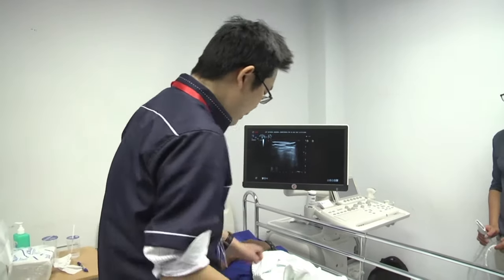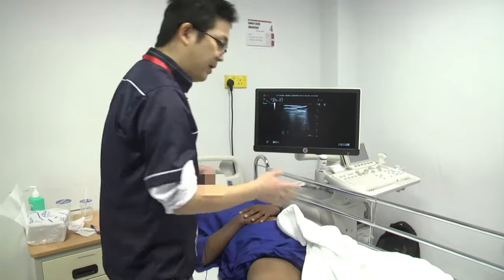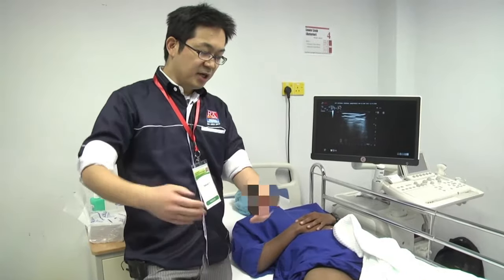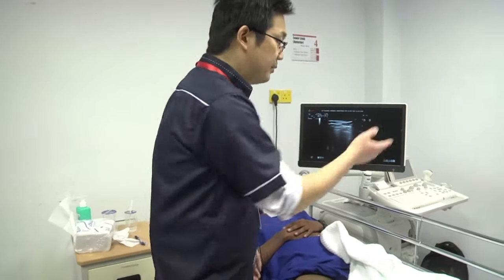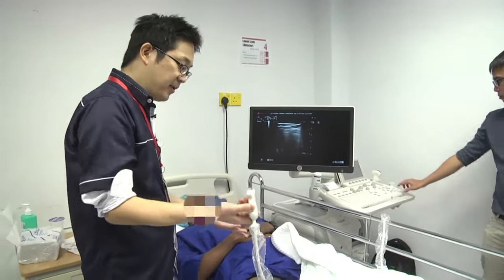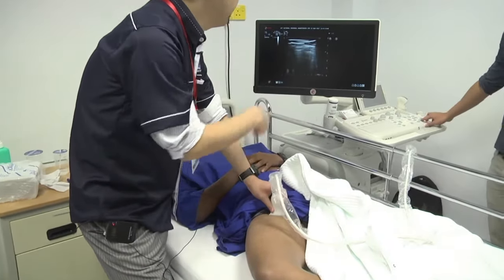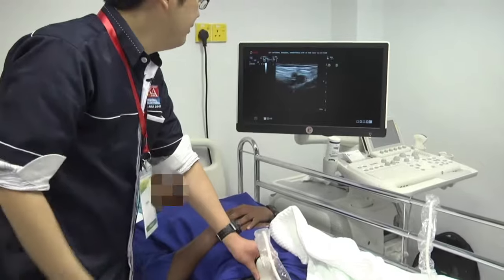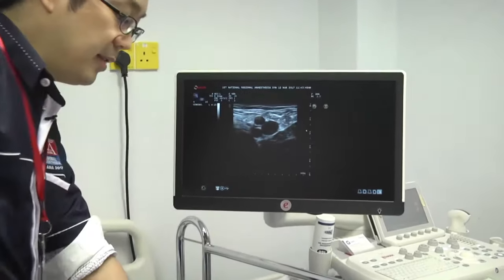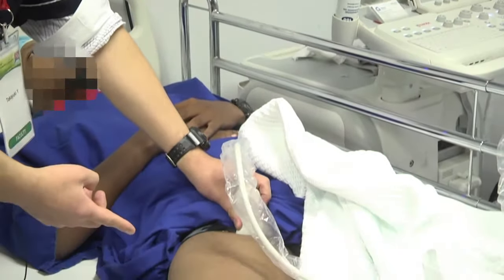With obturator canal block, I place the patient in the supine position with the hip slightly externally rotated like this. I first place the transducer on the inguinal crease like this, and first identify the femoral artery and vein. Then move the transducer along the inguinal crease medially like this.